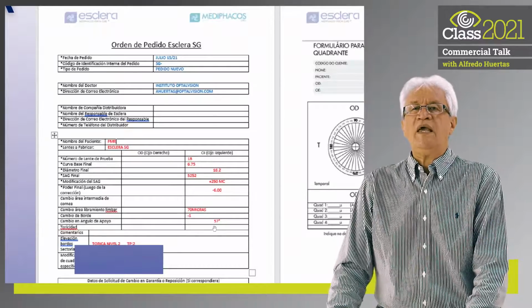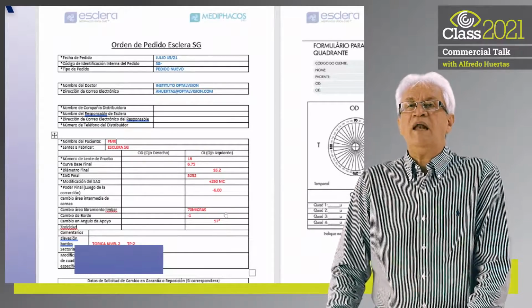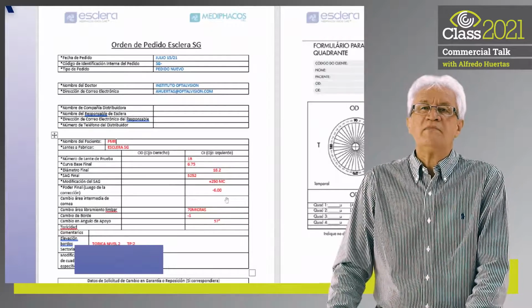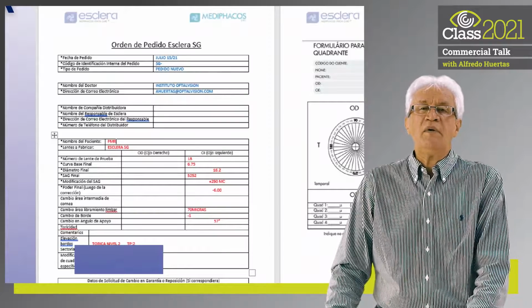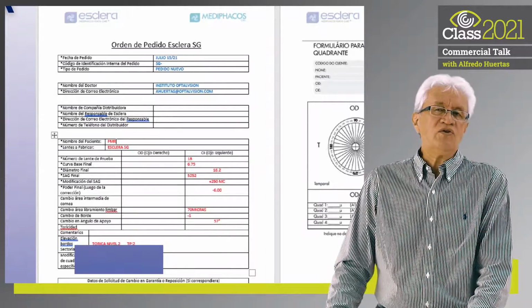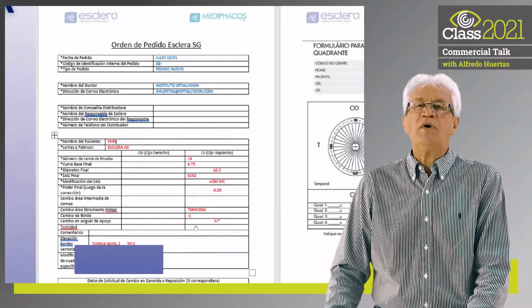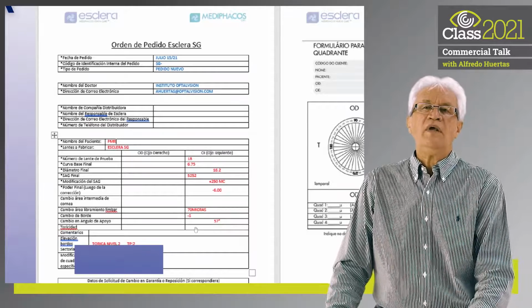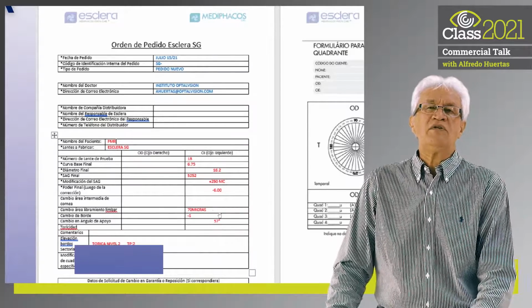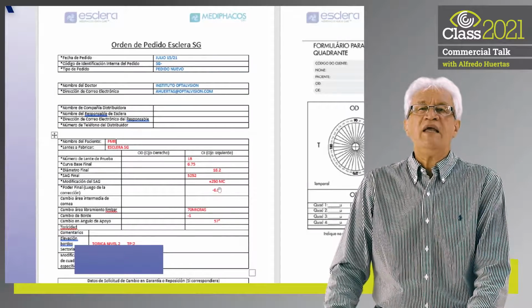We can observe that we increase the sagittal height by plus 250 microns. The final lens ends with a power of minus 6 and a diameter of 16.2. The toric level is 2, which is 250 microns. The edge, we changed it to minus 1, and the support angle, we changed it to 57 degrees.